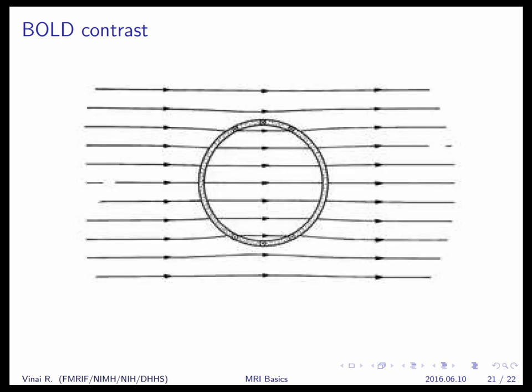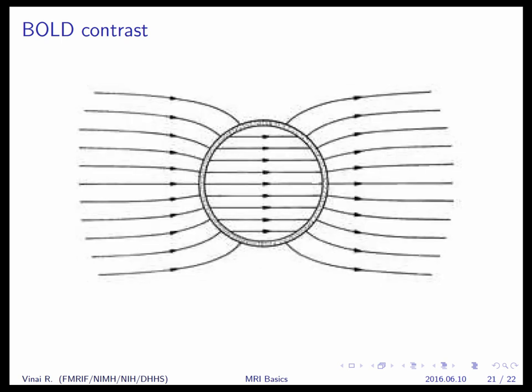And what happens in those cases is now the field within the blood vessels looks more like the background or the surrounding tissue. So if there's less difference here and less of a gradient, then what happens if you measure the signal now with the same timing parameters that you used in this case?